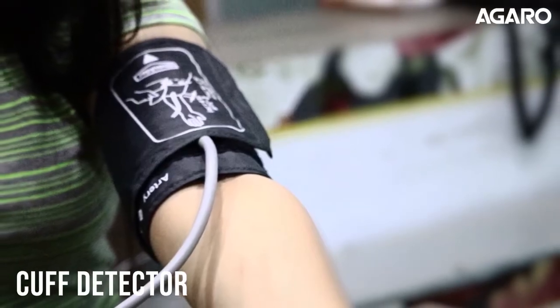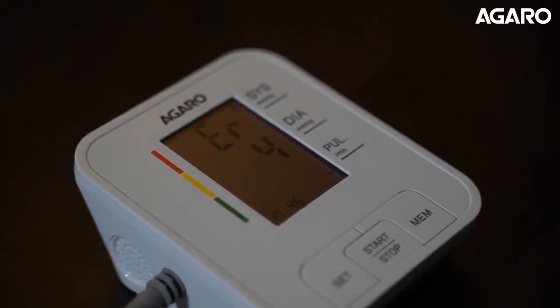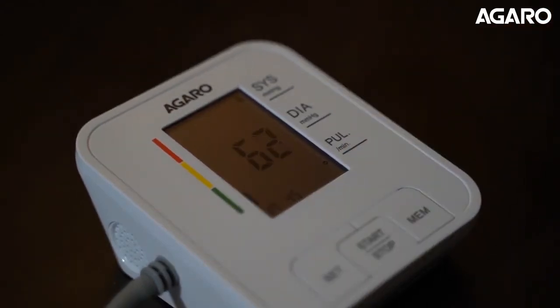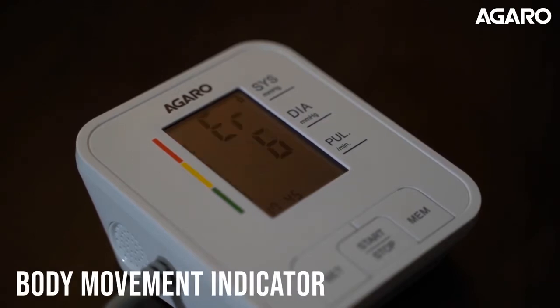It has a cuff detector that shows whether the cuff has been correctly put on or not. Improper wearing of the cuff will result in wrong readings. If you move during the reading, a body movement error icon lights up which alerts you to remain still during the reading.